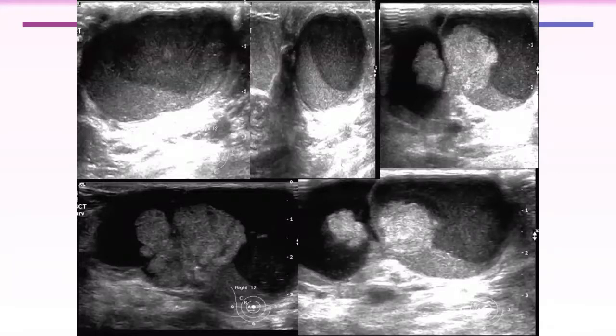This we call a papillary projection, and it is heterogeneous. Even the cyst component is not just echo-free. See, it contains different echogenicities. Fine. Color Doppler, with posterior enhancement. Okay. It was vascular.